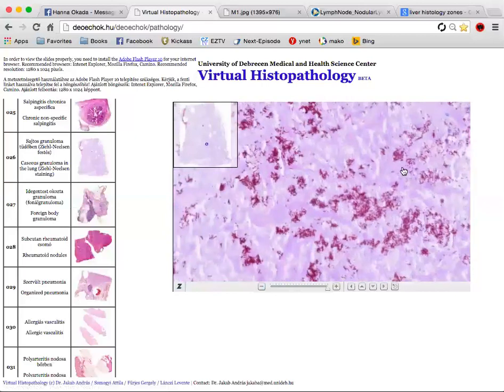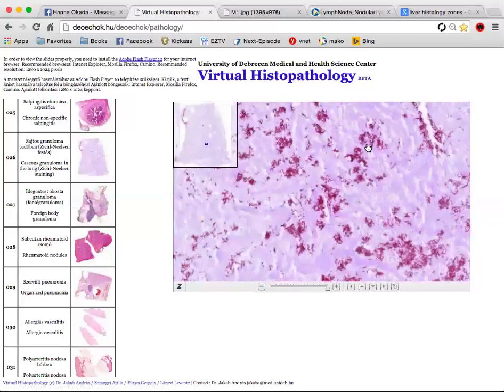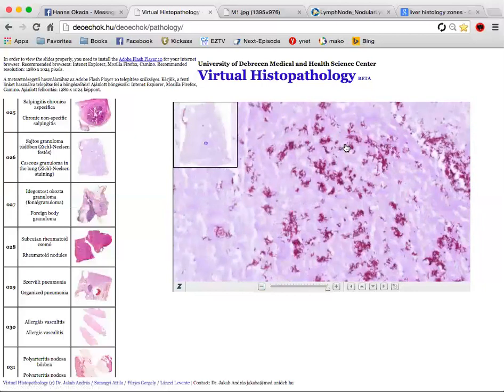Okay, but like what's his name? Csaba Molnar. He showed people in his class this area. But this is just free bacteria. This is not the granuloma. The granuloma is the purple thing. So this is like for free bacteria, free tuberculosis. Yeah, exactly.